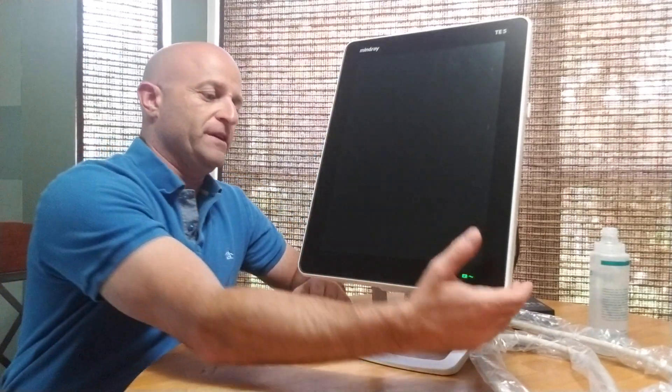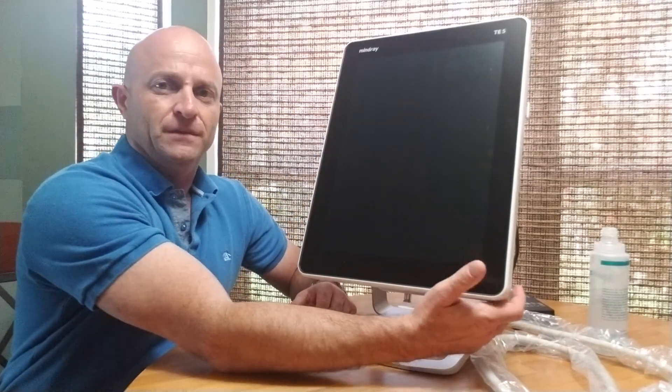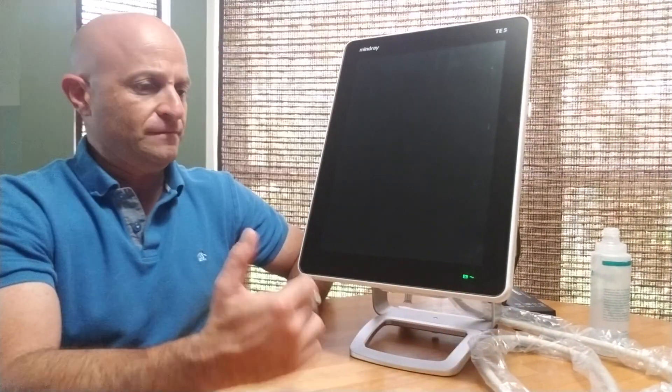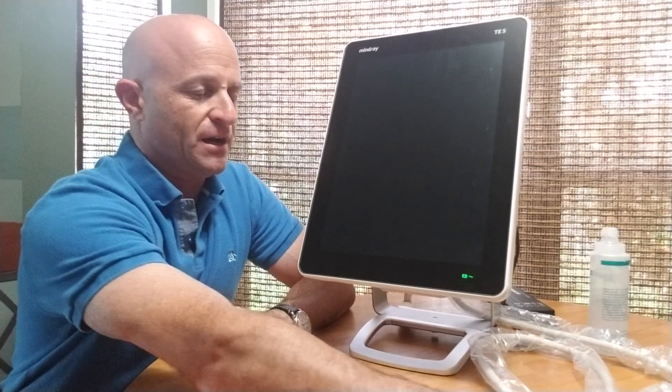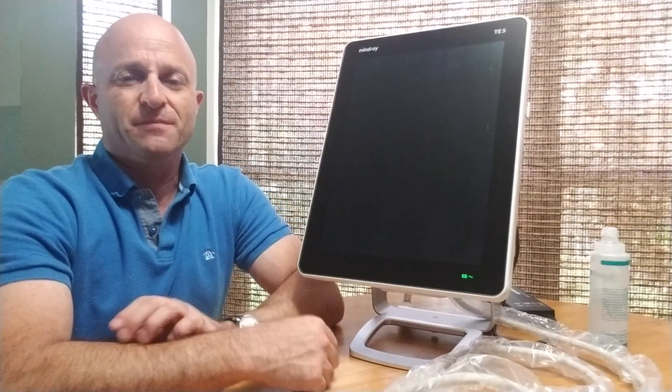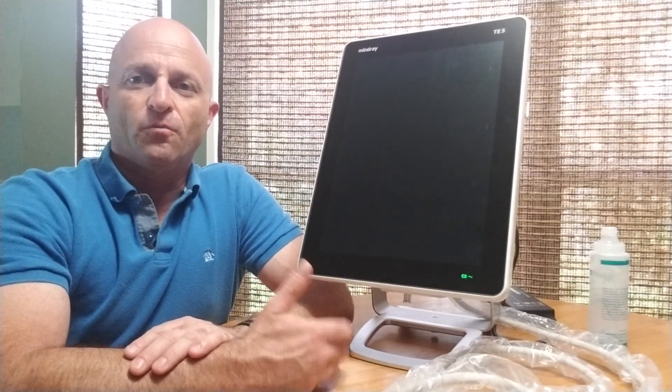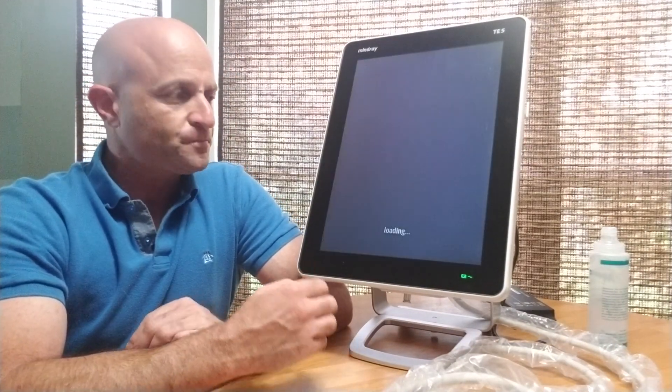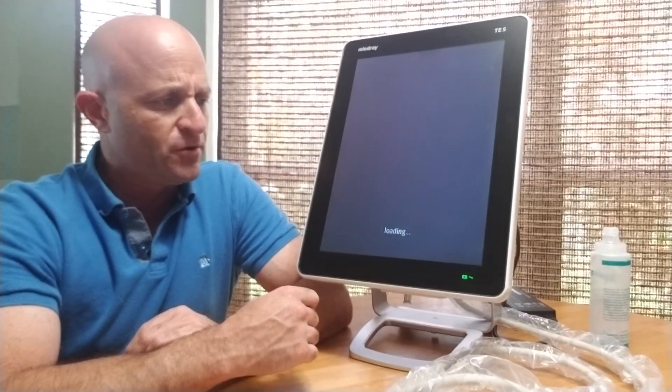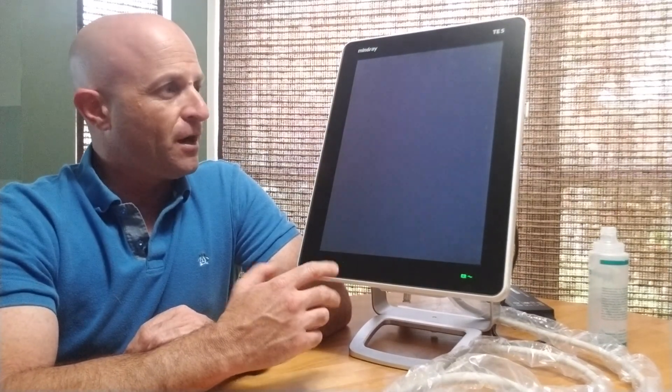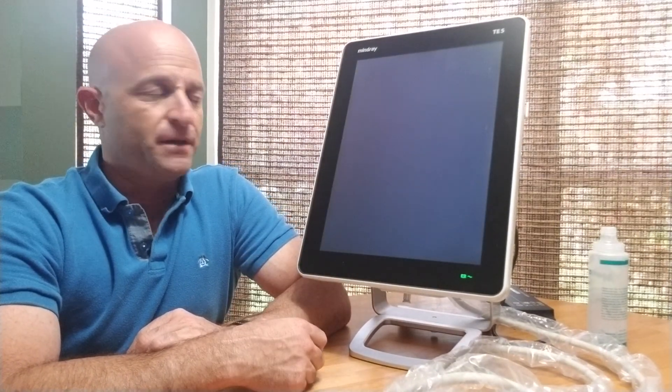One feature here is the very fast boot-up time, which seems to be common with Mindray platforms. It's got a quick boot-up and a nice backup battery.